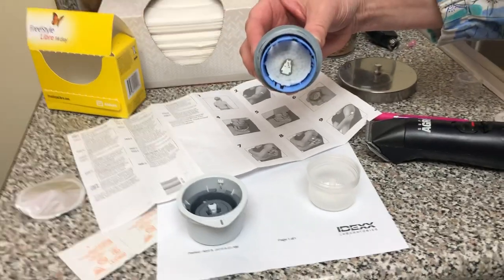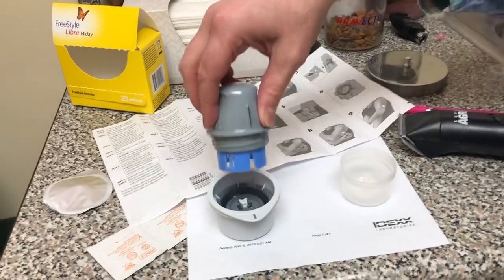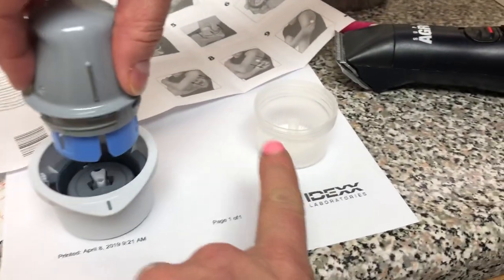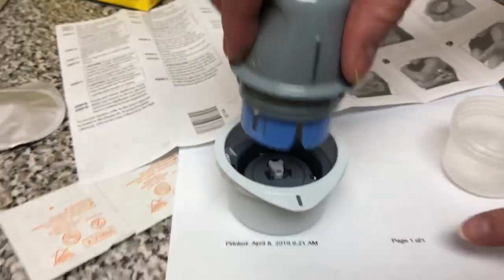This is our video on the Freestyle Libre and how to line it up, or how to load the cartridge on. So this comes in, and you undo it, and then you take this line and line it up with that line, and you push it down, and there it is. And it will load the cartridge in, which is the cartridge.